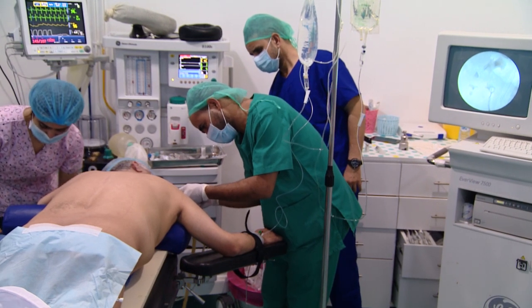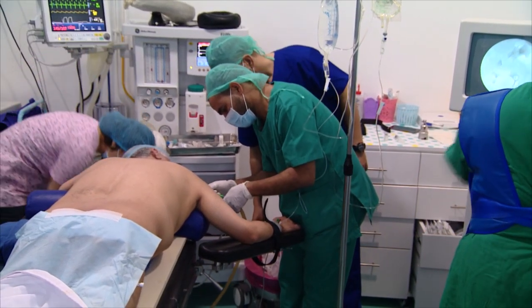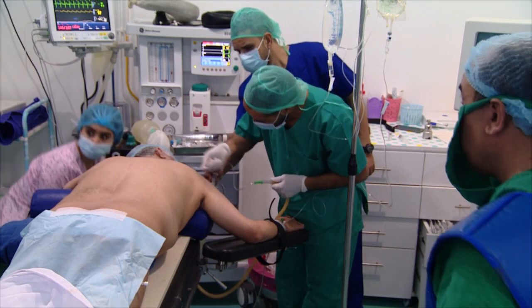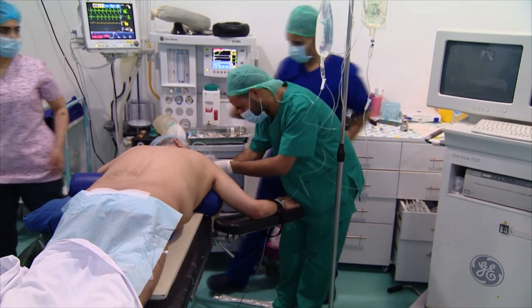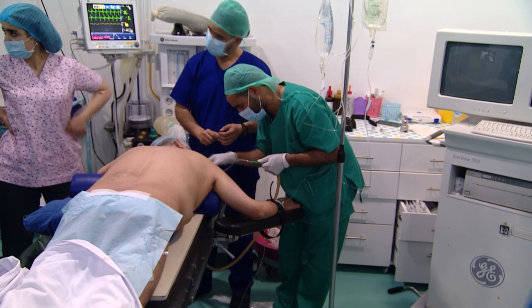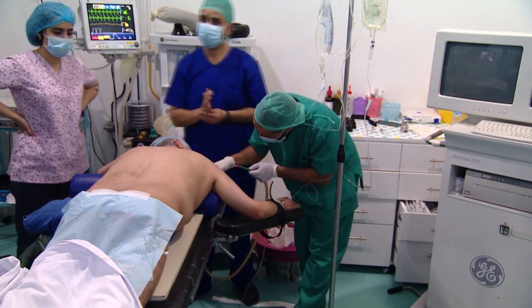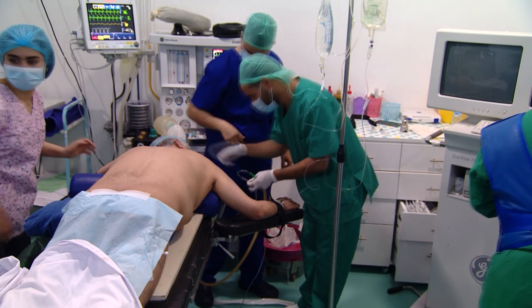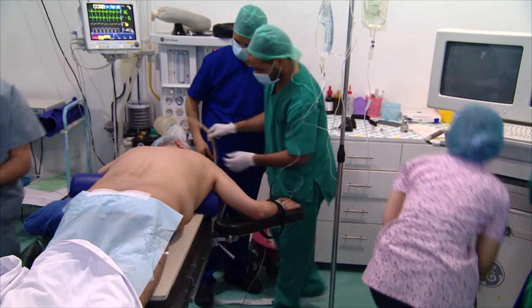Now you can turn the X-ray to this side. C-arm here. Ultrasound here. Okay, everything okay.